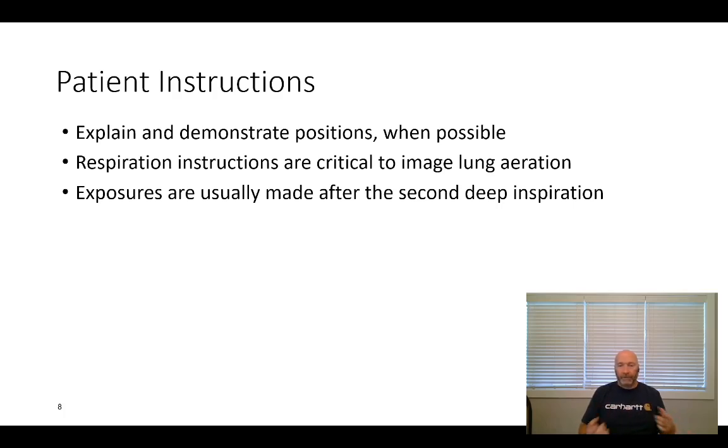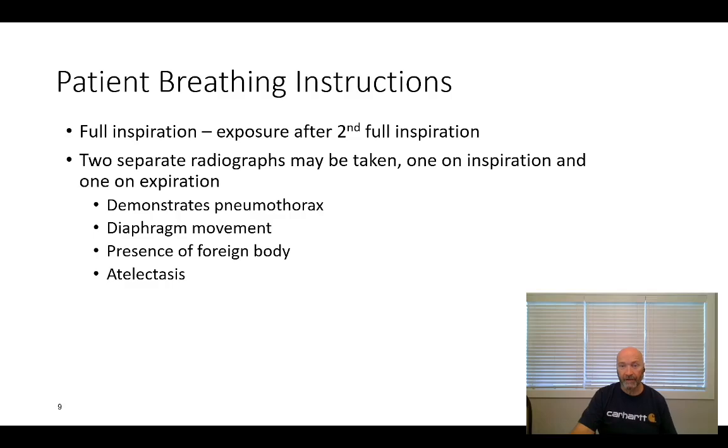You don't need to do 2 deep inspirations for lateral. So just the PA, unless you shoot the lateral first. That's something totally different. So full inspiration, expose after the second full inspiration. So there are times, though, where we may take 2 images, one on inspiration, one on expiration.